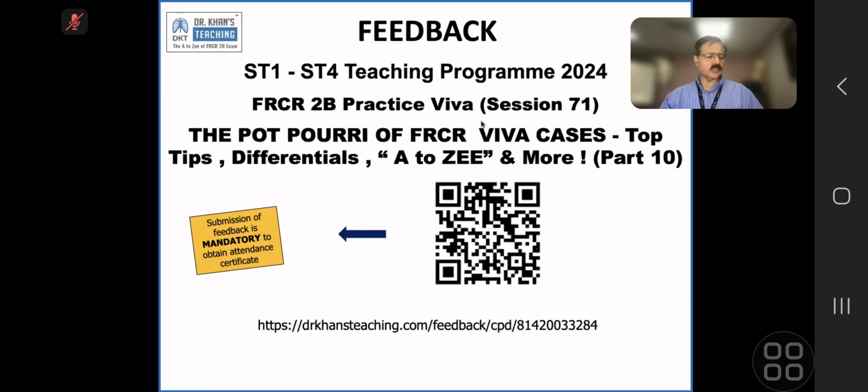So mucinous tumors, think like water. Mucin will be like water, as in very high signal, like urinary bladder, sorry, the urine, think like that. And so mucinous tumors will have that.